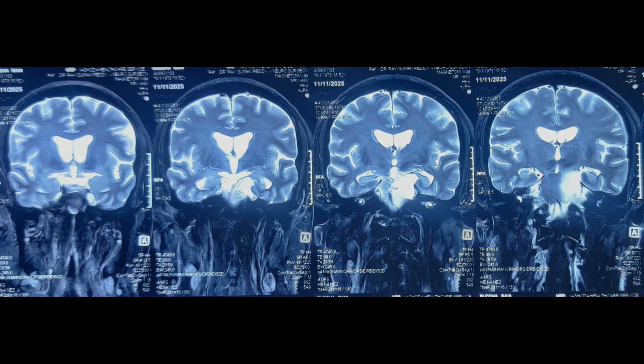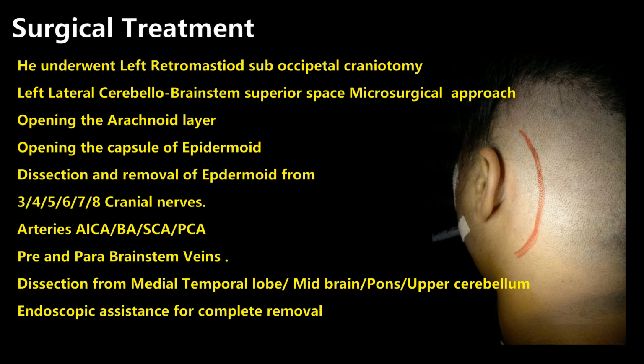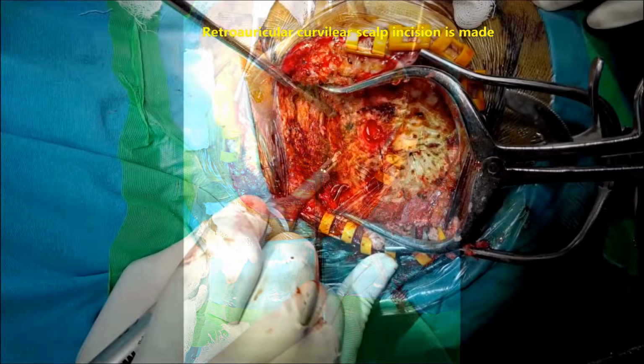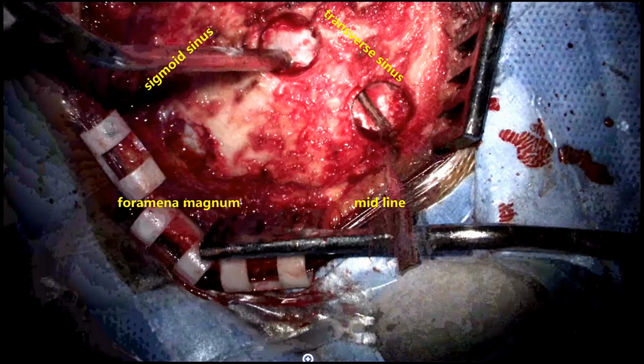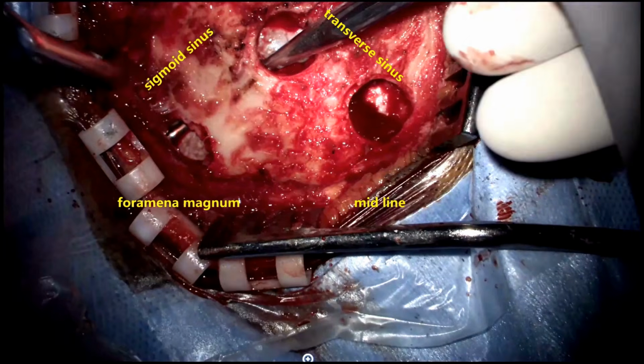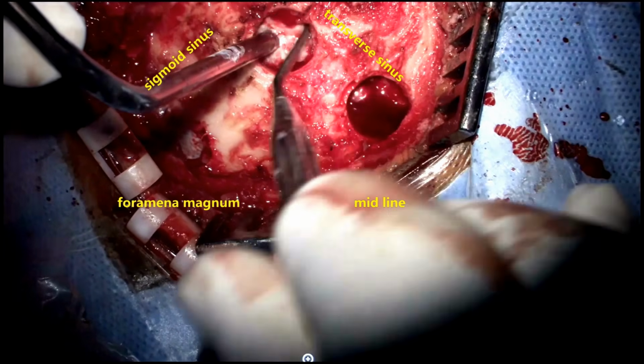With this, he was taken up for surgery and underwent left retromastoid suboccipital craniotomy, left lateral cerebello-brainstem superior space microsurgical approach through the exoscope. With the help of the endoscope, the whole tumor was excised, with the trigeminal nerve, all the nerves from 3 to 12, and all the blood vessels from midbrain, pons, and upper medulla preserved.